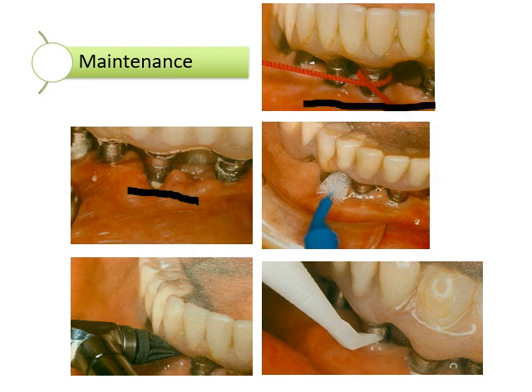You could use Superfloss up there to clean around that to kind of break up the plaque and calculus. Down in the lower left-hand corner is kind of like a rubber cup, kind of like our occlusal brushes in clinic. We don't have these in our clinic. You may see these out in private practice, but it's a rubber kind of gum stimulator, if you will, to clean up underneath the implant and the denture itself.